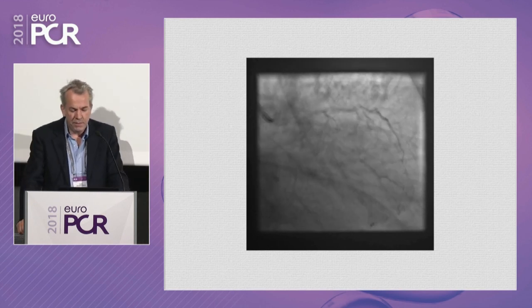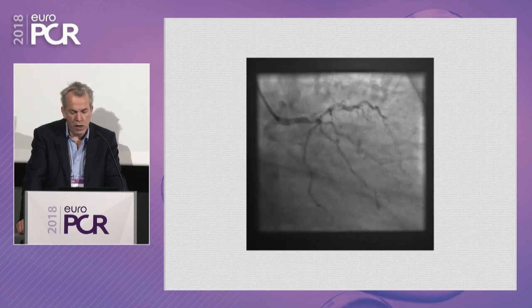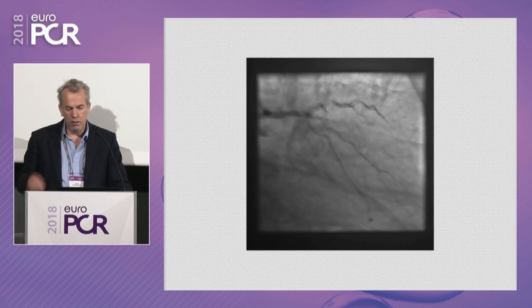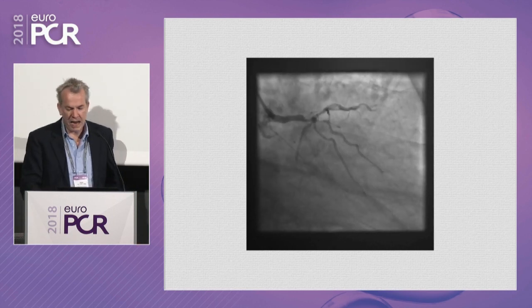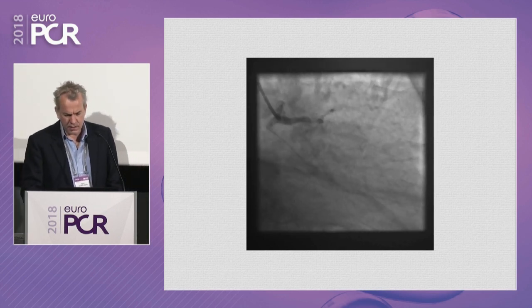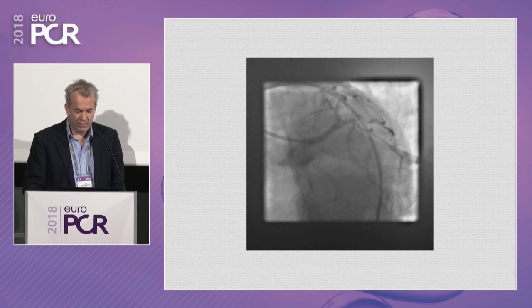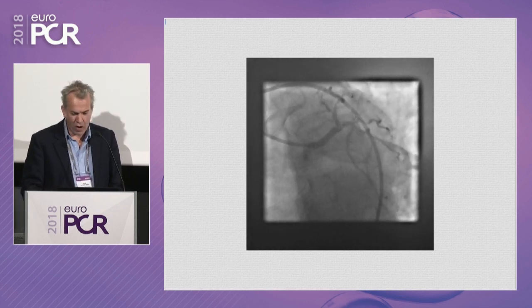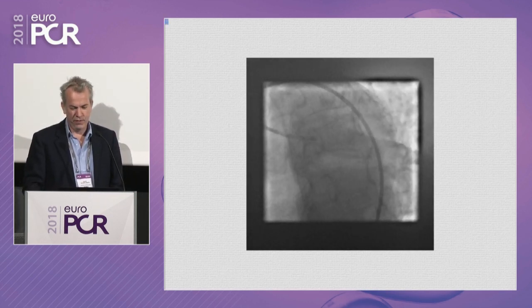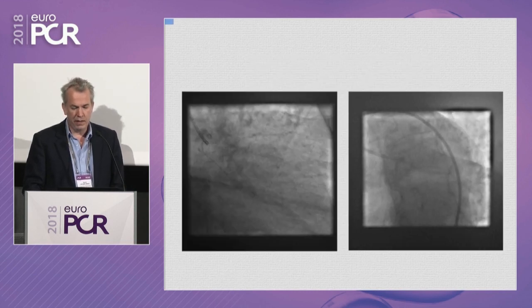So this is a patient who is 83, came in with an acute coronary syndrome, a smallish rise in troponin, nothing terribly major, but had had troublesome symptoms of angina preceding this. This is his angiogram from one of my colleagues. It's done from the leg, tragically, so the wrong access point to start with, but we'll let him off. And these are the two key views, okay? So I'm now going to play them side by side.